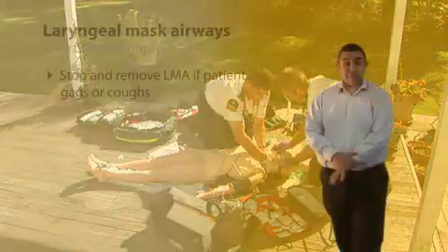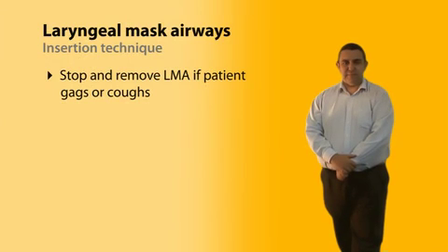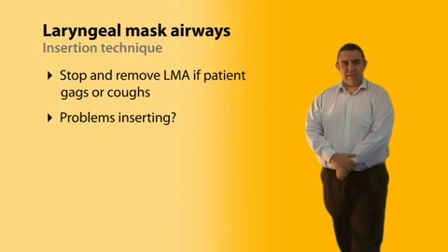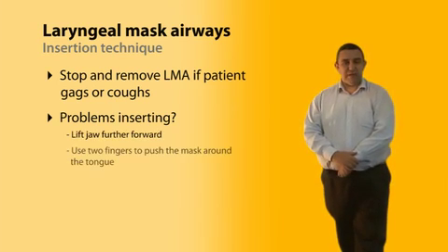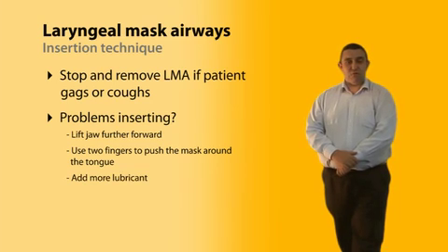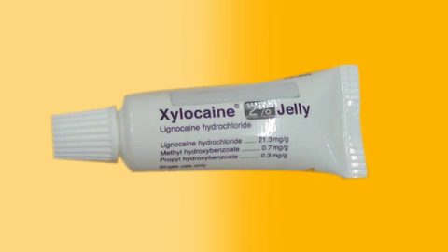If the patient starts coughing or gagging, stop and remove the LMA. If you are having problems inserting it, consider lifting the jaw further forward, or placing two fingers on the back of the cuff to push the mask around the curve of the tongue. Occasionally, insufficient lubrication may be the problem — a little more KY on the back of the mask may be sufficient to ease insertion.